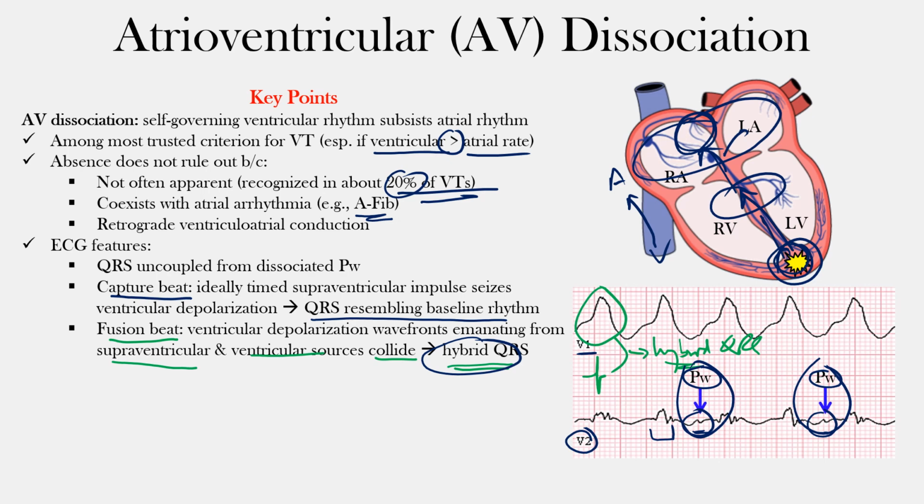Well, that's the end of this lecture. We discussed the importance of and how to recognize AV dissociation in differentiating wide complex tachycardias. I hope you learned something.